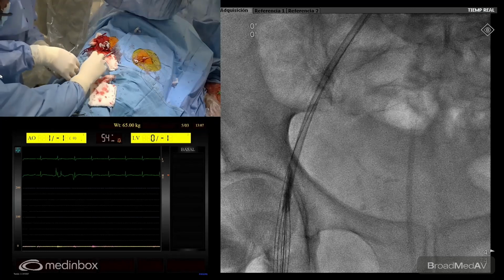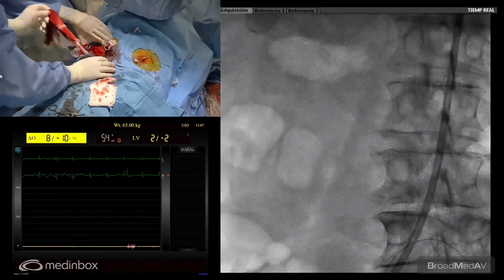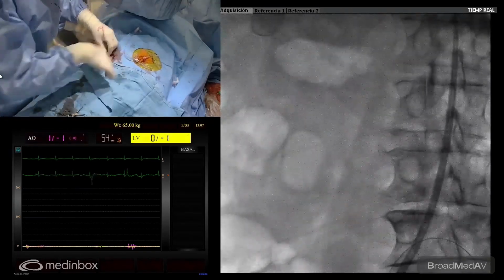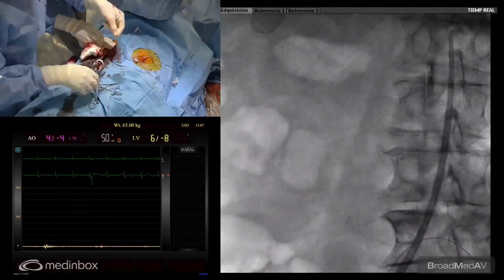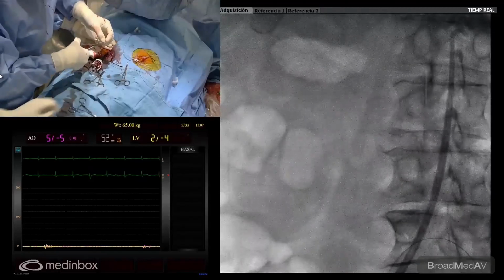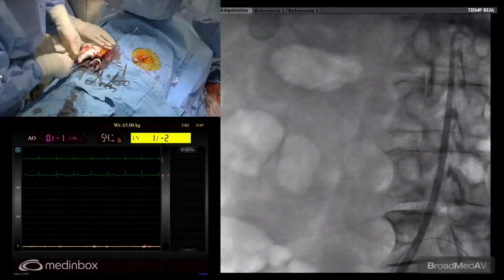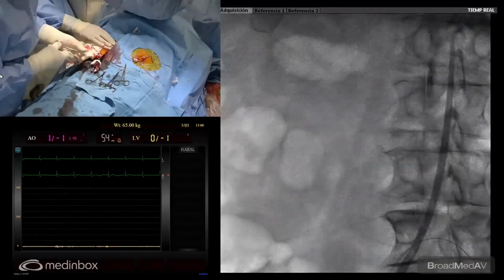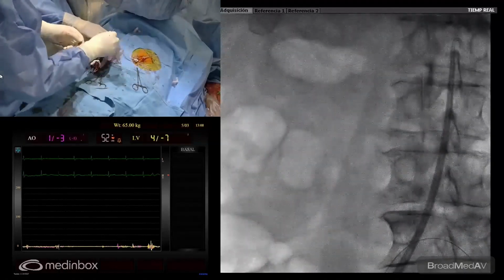Come here, Juan, to compress a little bit. Okay, needles out. Hold there. Have here this. And now I had to rescue the sutures. This is 1. This is 2. This is also white. And one of the green is also here. And here I have the additional one. So as you can observe, we have a rail from here and a rail from here.